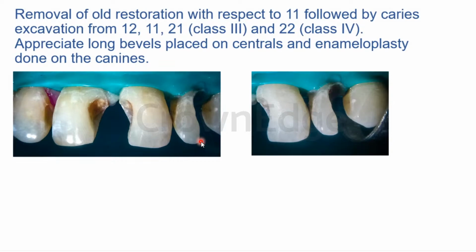You can see that phosphoric acid gel is first always applied over the enamel, and then we run it over the dentine, because dentine doesn't need to be etched as much. Otherwise it may lead to post-operative sensitivity. It can also lead to a lot of loss of bond strength. So it just needs to be etched for a very short time when you're using Adper Single Bond kind of bonding agents, like fifth, sixth, seventh generation bonding agents, right?